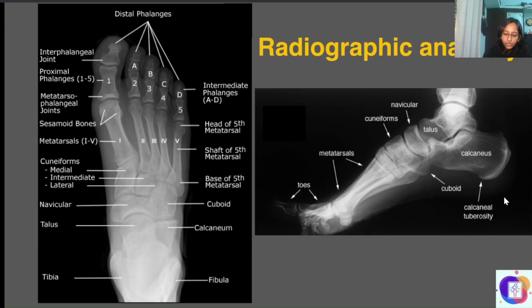And then coming to the navicular bone and the cuboid bone. These are a few of the tarsal bones. On the lateral view we have the navicular here. Anterior to these bones we have three cuneiform bones, the medial, intermediate and lateral cuneiform bones, although on lateral views the cuneiforms appear to overlap each other.